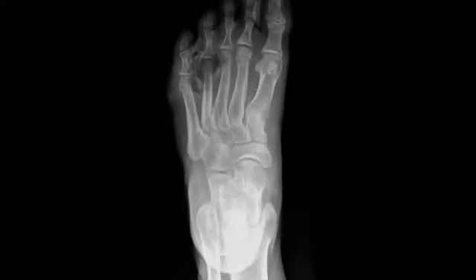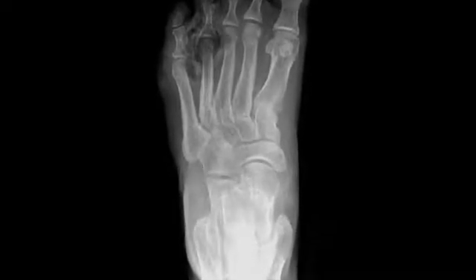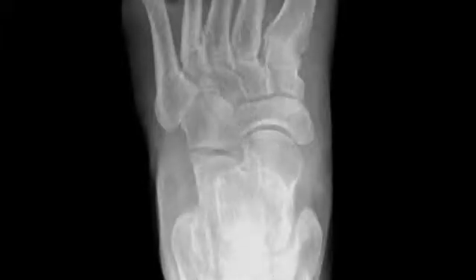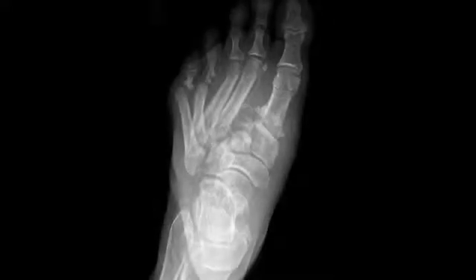This is the AP view of his same foot 1 year ago. He was treated for an ulceration in this area, but you can see alignment of the midfoot is anatomical with no indication of stress fracture, arthritis, or diastasis noted in the midfoot. The alignment is, for all intents and purposes, anatomical, and there's no indication that he was going to be developing a Charcot. And that's the difficult thing about Charcot cases: there's no x-ray signs that we can tell until it's too late, and then you see this severe fracture dislocation develop.